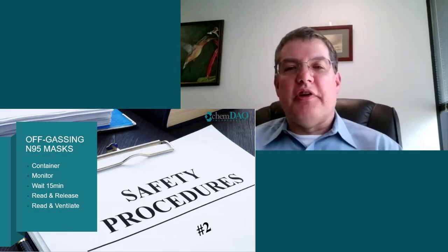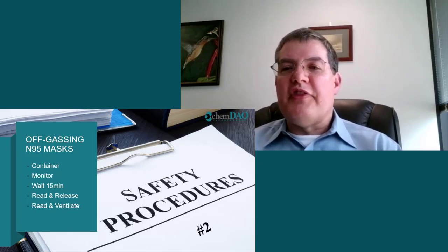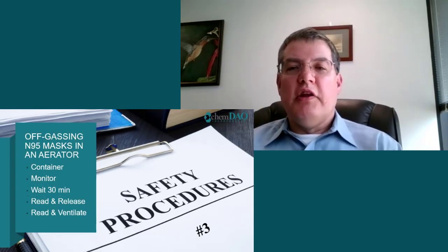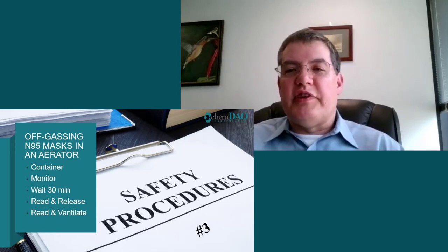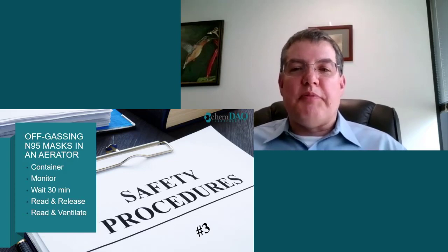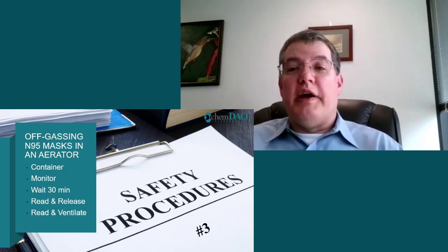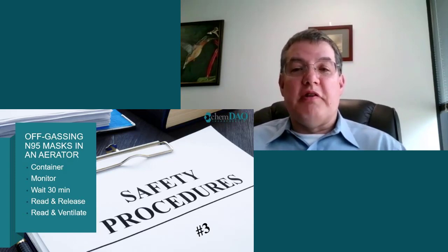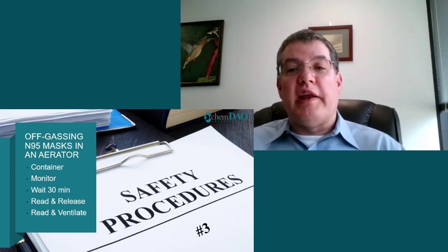For mask reprocessing using room disinfection, the best option is to use the method just described because of the large volume of masks involved. If a lot of masks are being disinfected using sterilizers, then having too much hydrogen peroxide vapor evaporating into the ambient air is probably not a good idea for the people who work there. It would be better to put the mask into an aerator or into a hood with an exhaust. This will remove the hydrogen peroxide vapor safely.